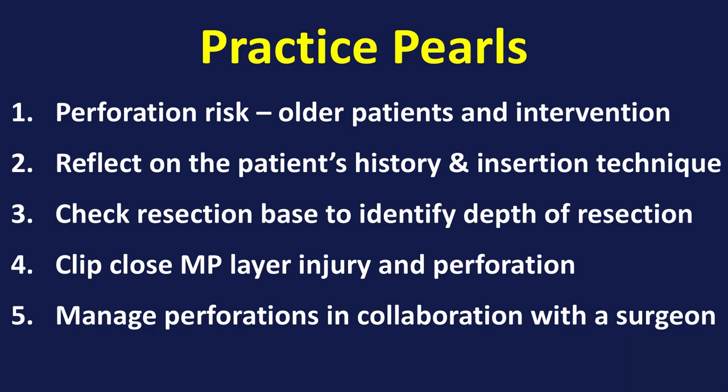Let's talk about some learning. Let me conclude by saying that patients who are older are at a higher risk for perforation. Colonoscopy with intervention is at higher risk for perforation. And in order to prevent mechanical injury and perforation, you should reflect on the patient's history and also feel how your scope is feeling as you're going into the colon.